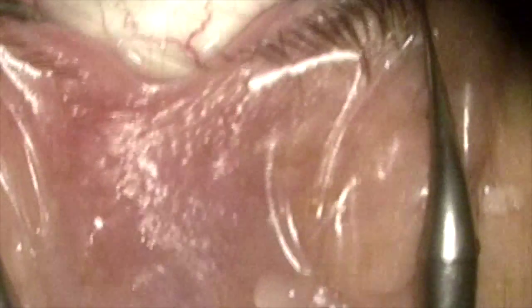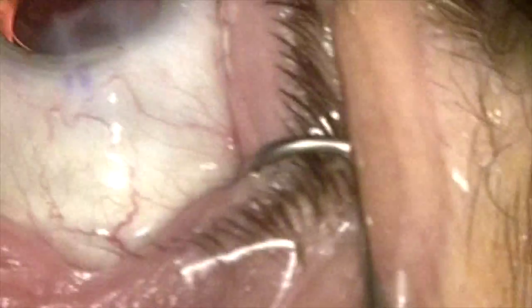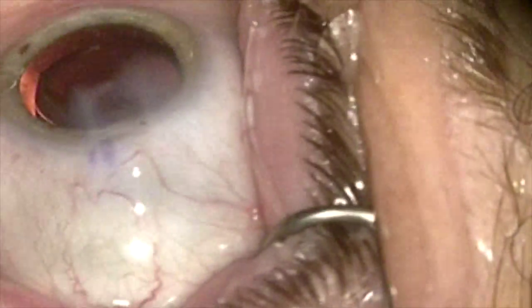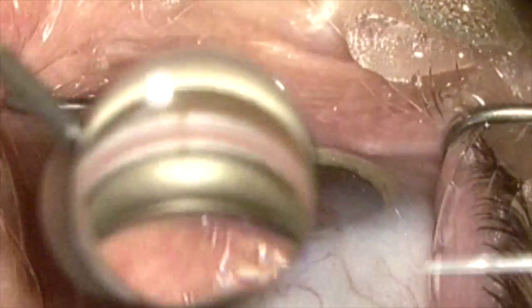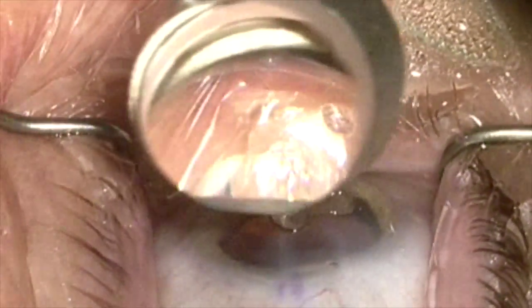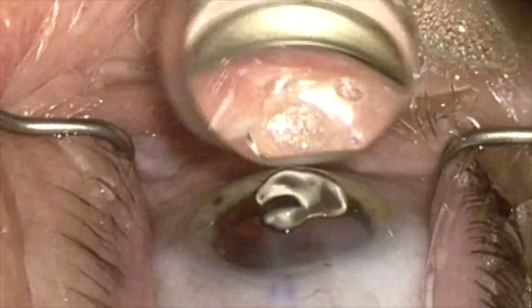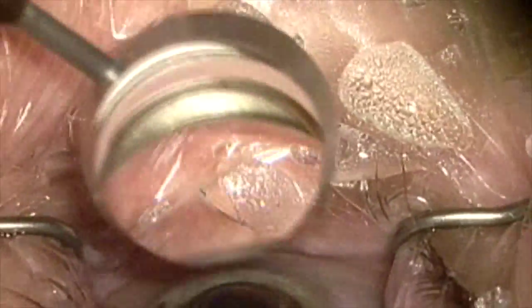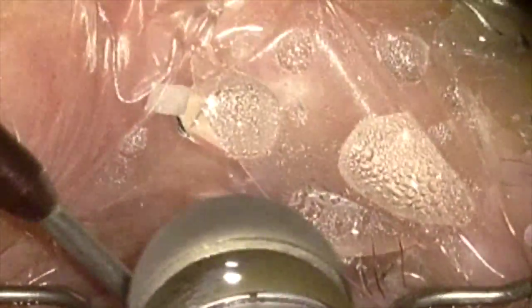I have the microscope preset marked to 30 degrees and I just rotate the microscope with my fingers until I get to that preset mark on the scope. Once the microscope is in position, I've rotated the patient's head 30 degrees, and I've told them prior to surgery where to look straight ahead so that they've basically rehearsed this beforehand.